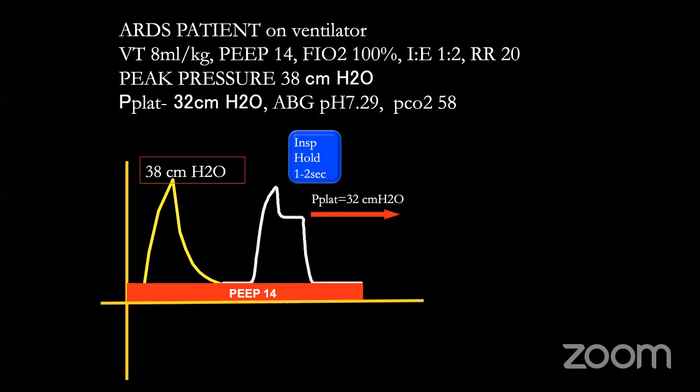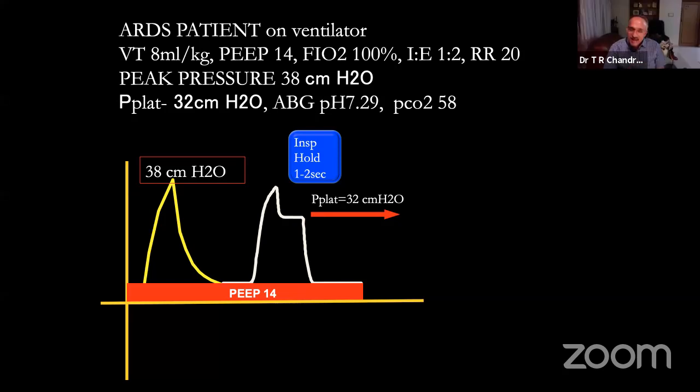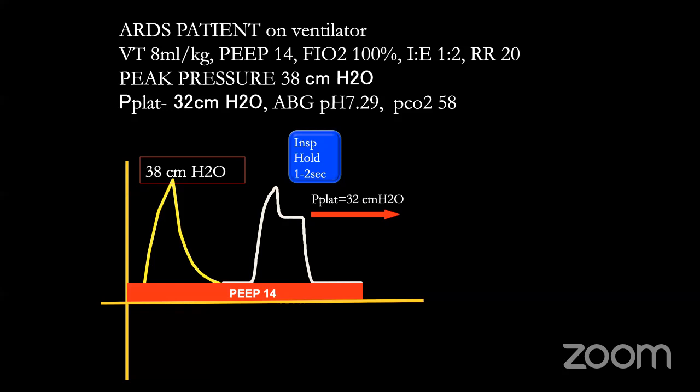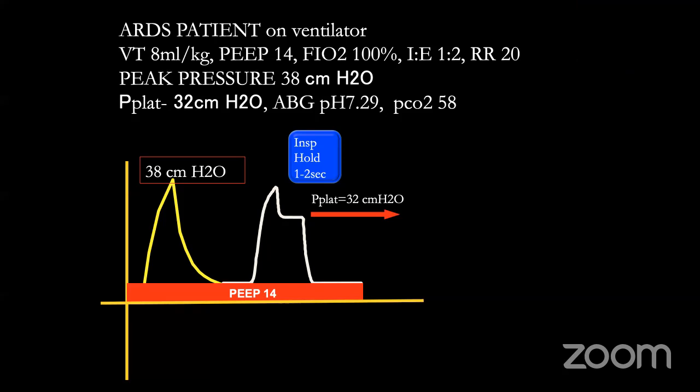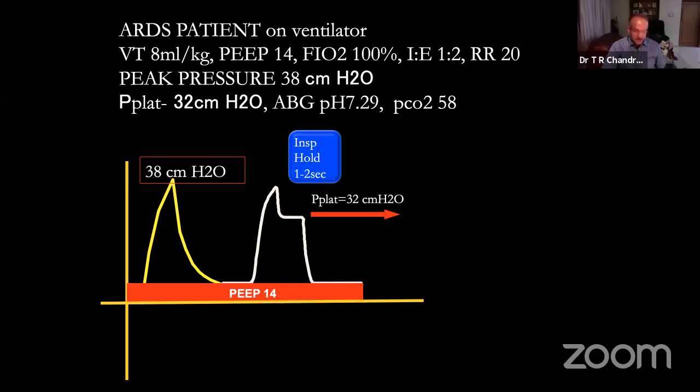So 6, sir. 6 is not around 8 centimeters you require to push the air, isn't it? That is the normal resistance, isn't it? On a ventilated patient, what is the normal resistance? 8 to 10 centimeters. Then it is only 6. So sir, then we have to decrease the tidal volume. No, that is apart. Then why did you say nebulization? That is my point. You didn't analyze properly, isn't it? Remember, you should not make this mistake again.